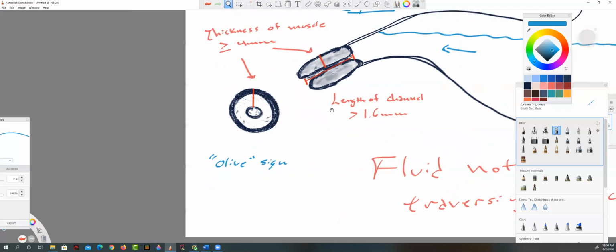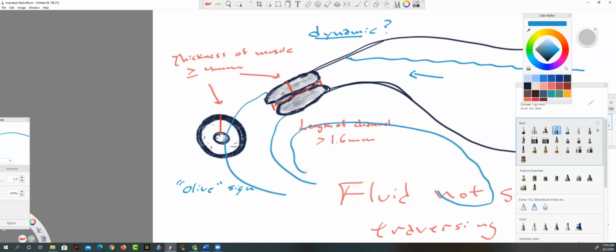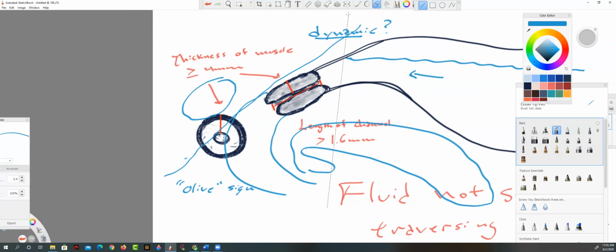Actually, so we know we can follow the stomach. Of course, let's think about what else is here. Let's see. We have duodenum here, which means the pancreas is there, which means the liver is here, and the gallbladder is right about here. So the midline of the body will be about here. So just to the right of midline, at the end of the stomach antrum, or the end of the stomach, which is not always easy to see and understand, but we know it's in this area, medial to the gallbladder and liver, of course.